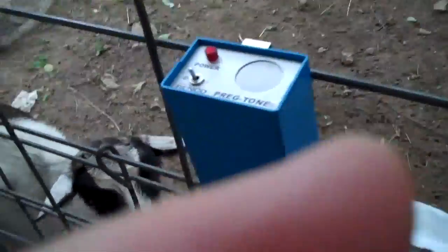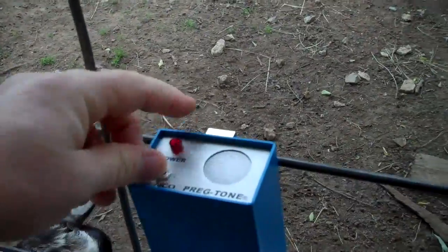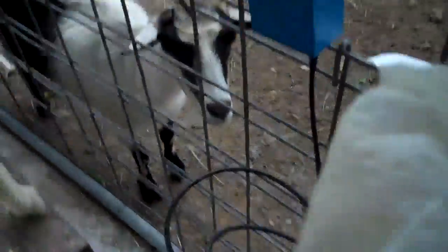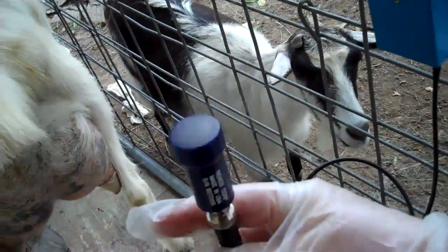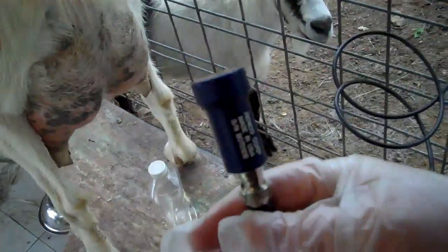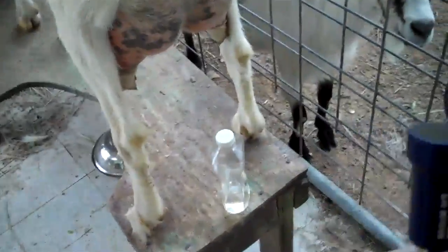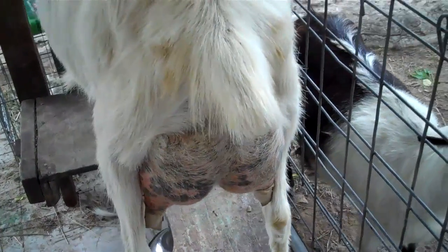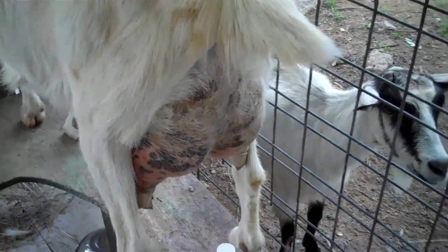It's a battery-operated device. You turn it on and it makes a tone. This is the wand. You put it on their stomach and point it in the right direction, and it will make two different kinds of tones — either a solid tone for pregnancy, or a beeping tone if not pregnant.